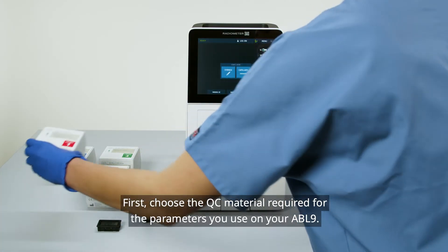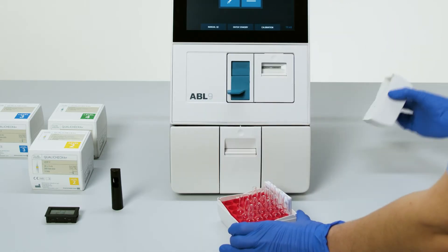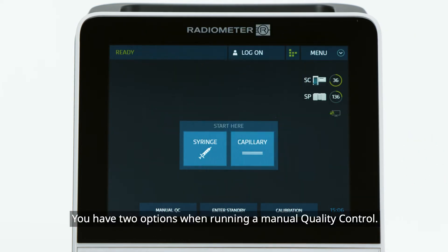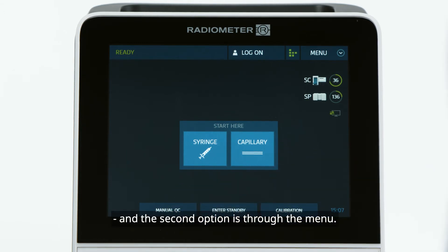First, choose the QC material required for the parameters you use on your ABL9. The analyzer must be in ready mode. You have two options when running a manual quality control: the first option is the shortcuts, and the second option is through the menu.